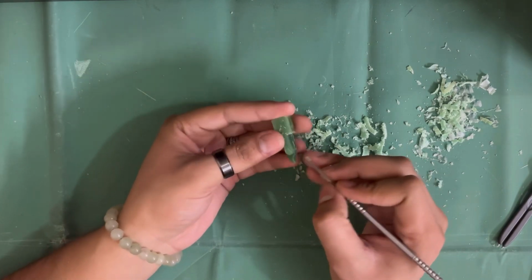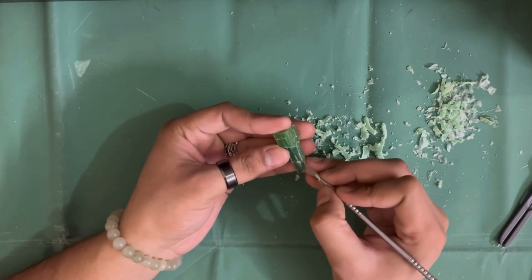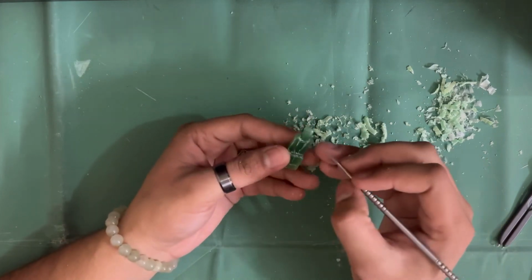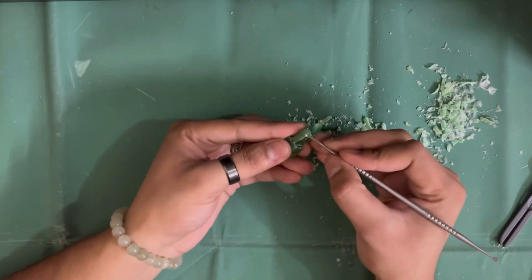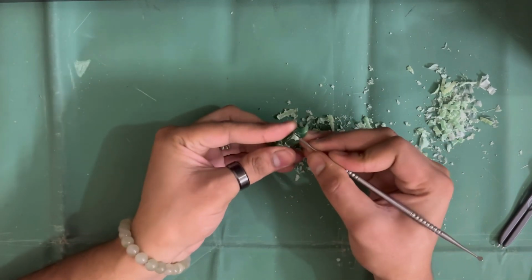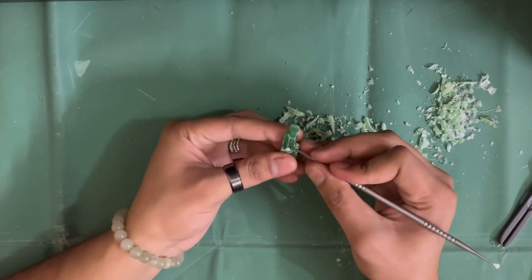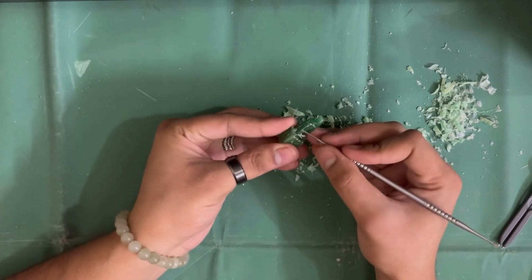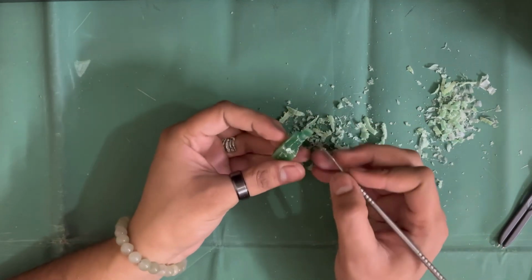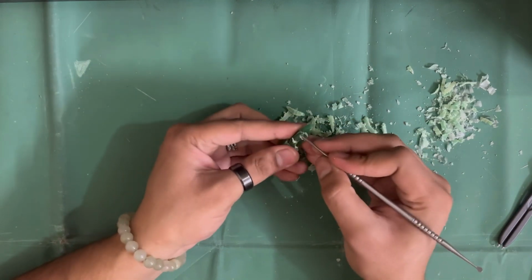Here I still had some extra wax on the cervical line, so we are carving that out. Now we are achieving the rough shape for the root.